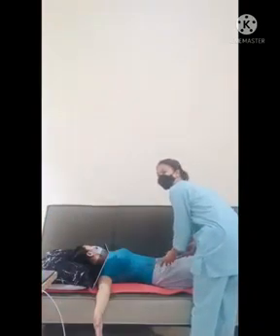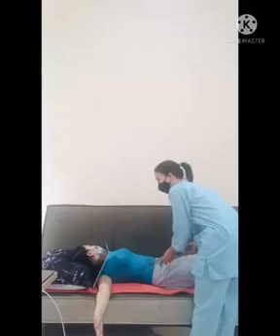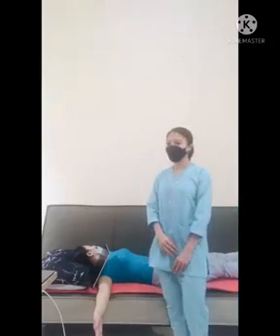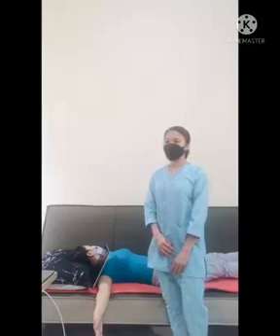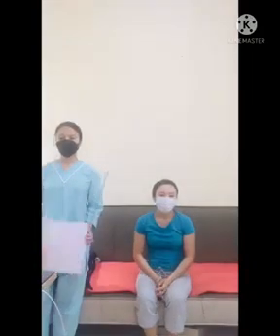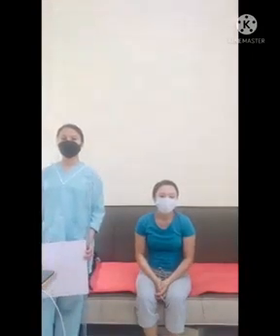Our central ray in this projection is directed medially 15 degrees, centered horizontally to the axilla and humeral head. The structure shown in this projection is Hill-Sachs compression fracture, proximal humerus, and the scapulohumeral joint.